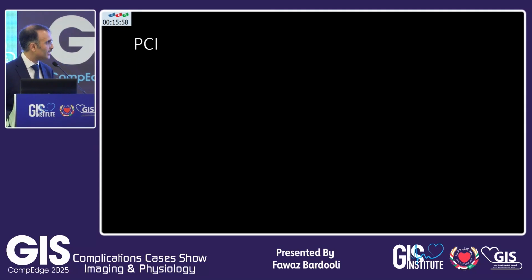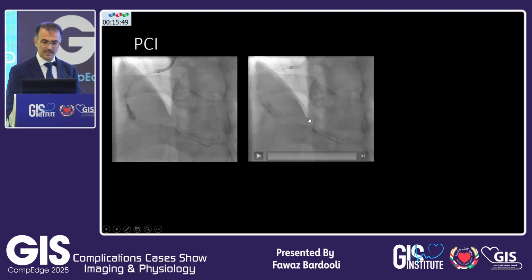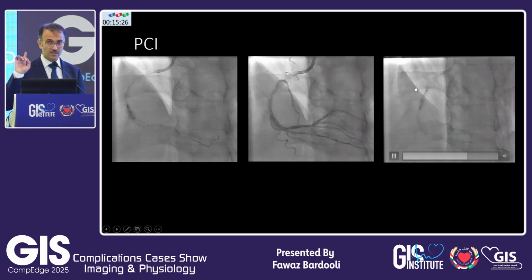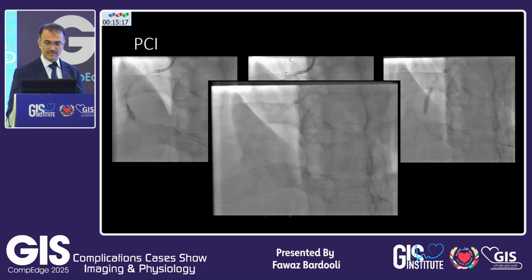Now, what has happened in this case, probably if you remember, and I'm going to walk you through, took wire, pre-dilate, multiple small balloons didn't work, IVL taken, IVL ruptured, and we got a good result at this point. Still, we did not modify the area proximal to the stent. We took an OPN balloon 4.0, size 1:1 to the vessel, and I'm going to keep this running. So you've seen that we've done the OPN to this area and it is fine, and we pull the balloon to the proximal segment. Remember what was there in the proximal segment, right? And what has happened is you dilate it, and then patient screamed. And this is what has happened.